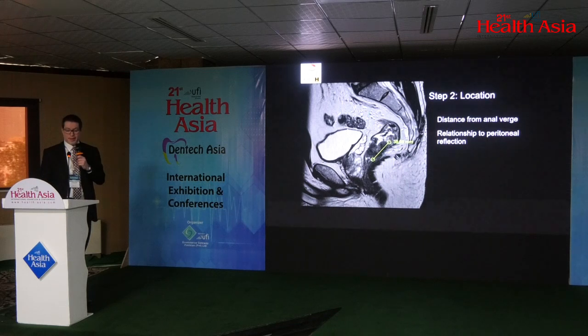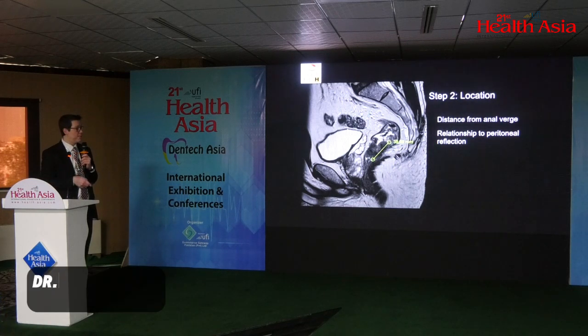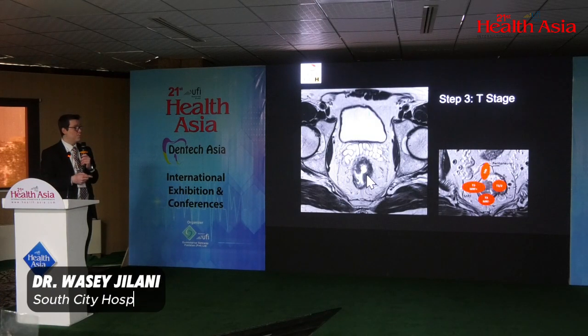Then we move on again, beyond the location and relationship to the peritoneal reflection, you measure the disease craniocaudally, measure what the distance is like. This also has to go up as part of the report. As we move beyond the size and location, the next step is this T stage, which is very important as far as staging of the disease is concerned.